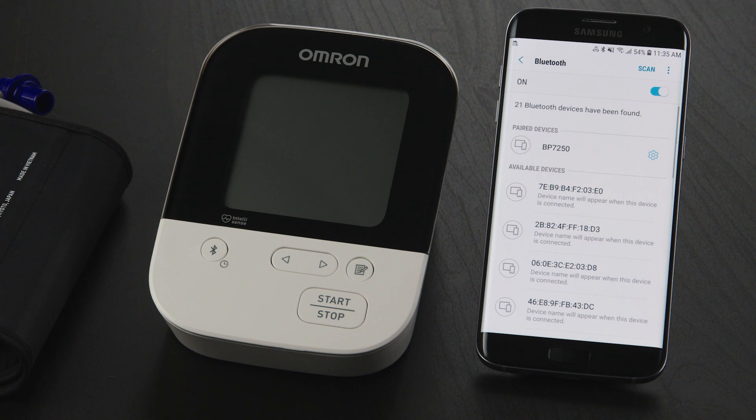If you don't see any of those devices listed, skip the next few steps and open the Omron Connect US Canada app.